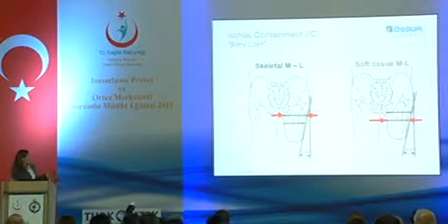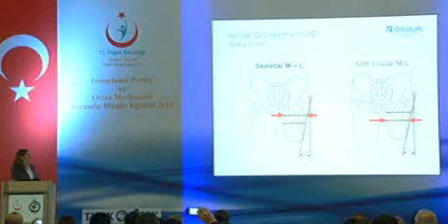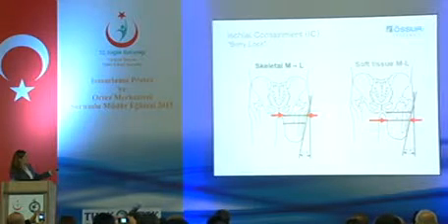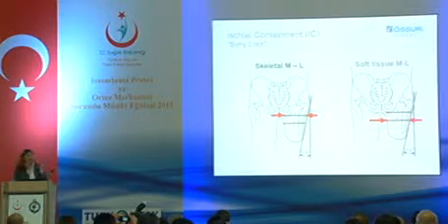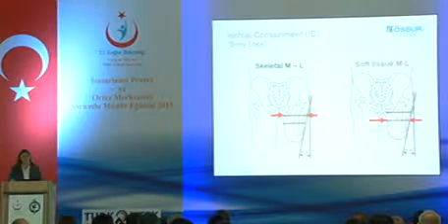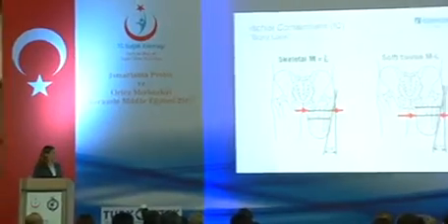We make use of the skeletal medial lateral measurement as well as the soft tissue medial lateral. So the relationship between these two measurements will help to create that bony lock. Bu iki alacağımız ölçü tabii yumuşak dokuyu da hesaba katarak alacağımız bu iki ölçü bizim soketi dizayn ederken kullanacağımız ölçüler olacak.